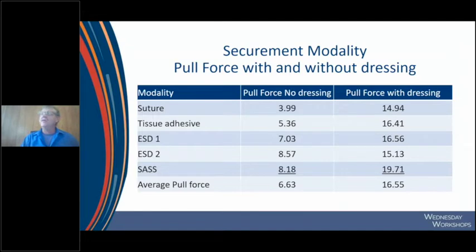Speaking of curiosity, my curiosity led to this little study, and it really was more of a demonstration. I had about 23 different securement modalities and configurations, the different securement methods with and without dressings. This is the chart that you're seeing in front of you. All of these are without the dressing, and these are with the dressing.